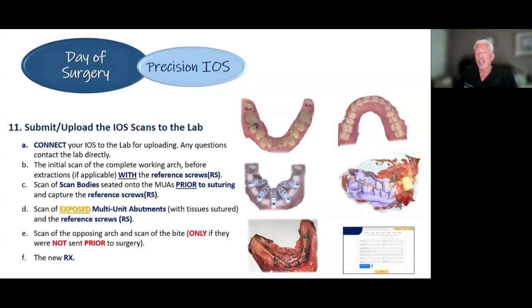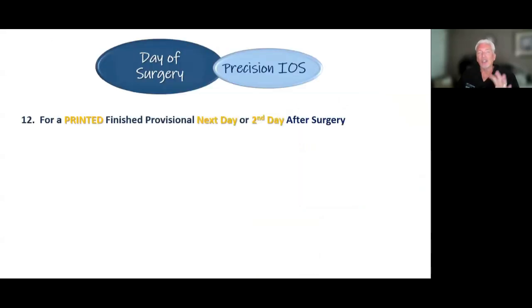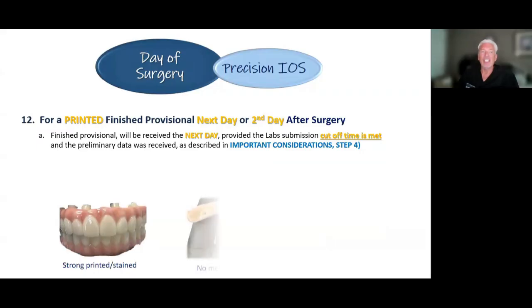Then you're going to see the intraoral scans: the scan of the exposed multi-unit abutments, the working arch, the bite. Then you're going to fill out the prescription and send it into the laboratory with that. Most labs have online prescriptions with nice, easy drop-down boxes to fill in to give them the information that they need.